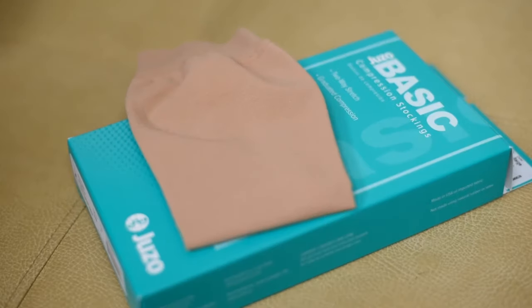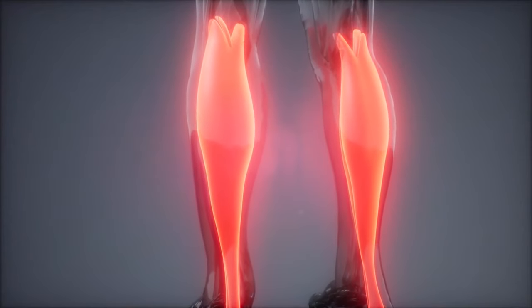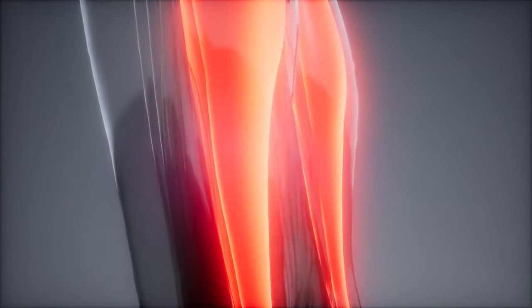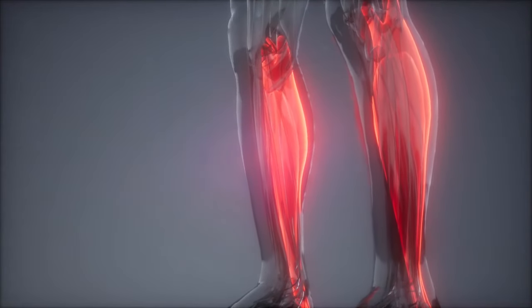Compression stockings are used to help the calf muscle actually push on the veins that are already in your body — your deep veins as well as your superficial veins. Your calf muscle is really your pumping function that allows you to pump blood back up towards the heart to get recirculated, and the compression stocking essentially aids that calf muscle in helping push that blood back up towards the heart.